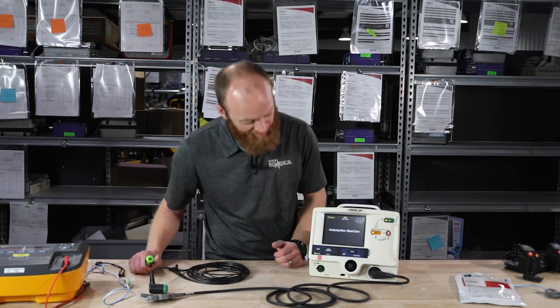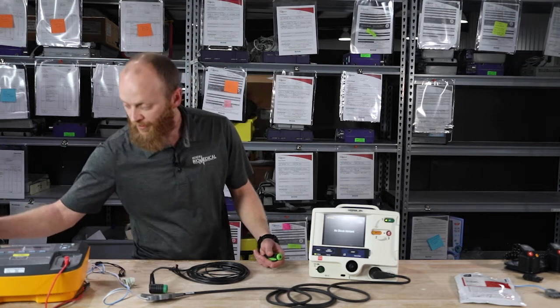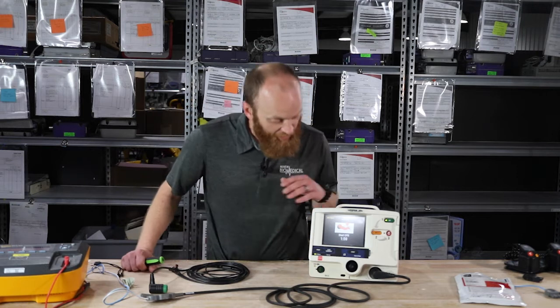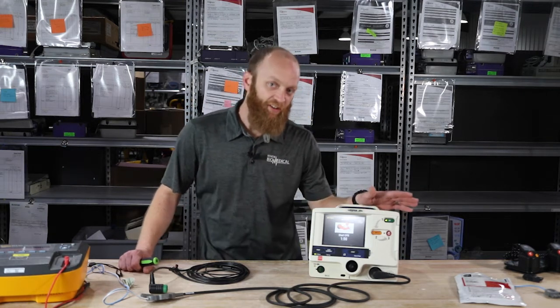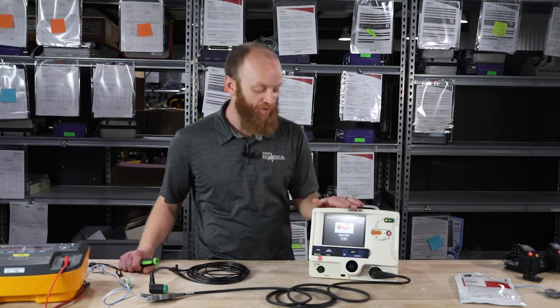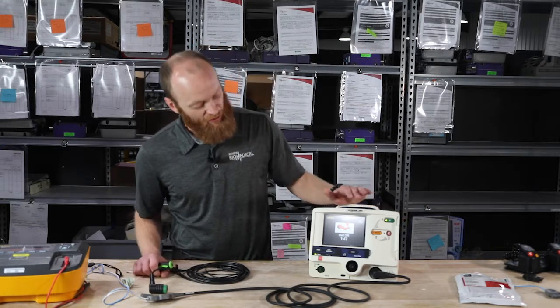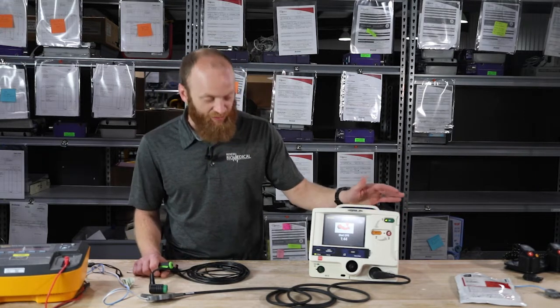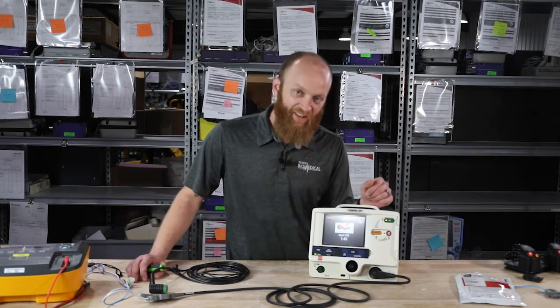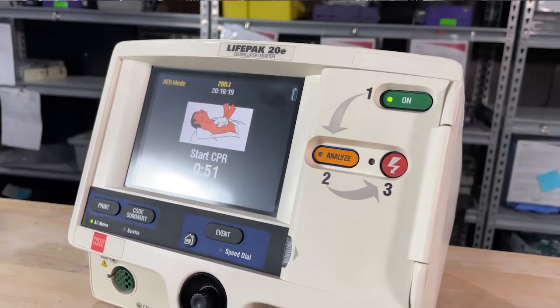We hit Analyze. Analyzing now — stand clear. No shock advised, start CPR. The LifePak 20E didn't detect a shockable rhythm; it didn't detect VTAC or VFib, so no shock advised. It goes into instructions for CPR, which continues for two minutes. It will then reanalyze and inform you whether or not to perform the shock.